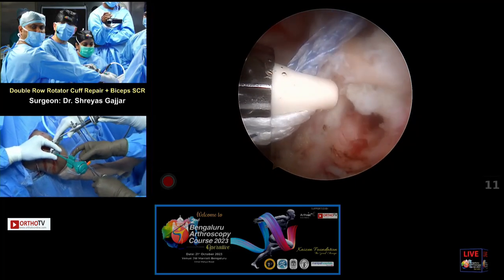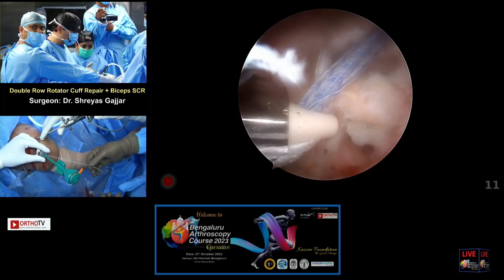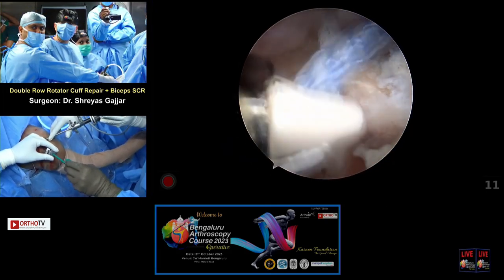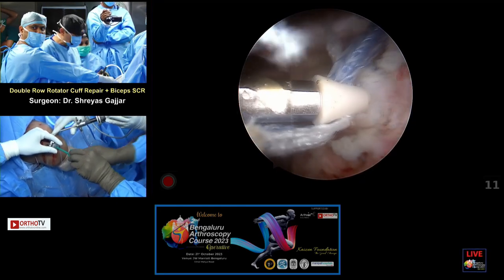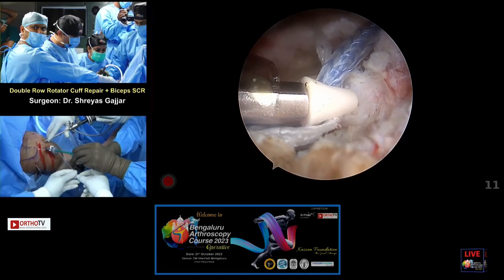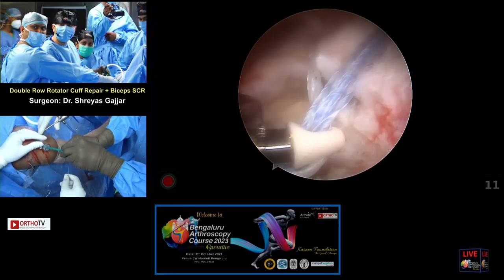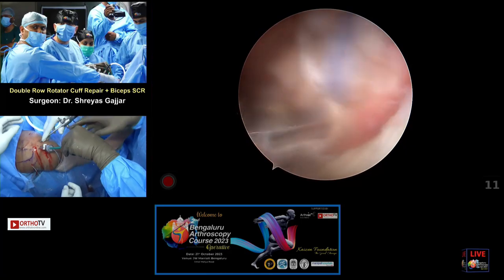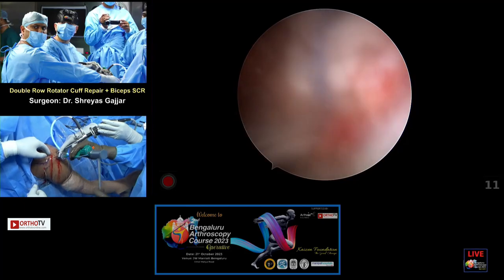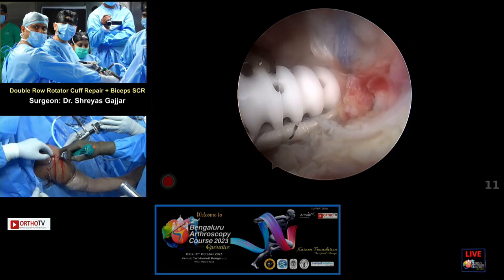Now, once you pass the eyelet through and it's near the lateral hole, you remove the mosquito from the tapes so that you can have a tension-free setup. What you need to do is come above the hole here, and then my assistant or I will pull the tape. So give me one tape at a time. Yeah, just hold on. That's enough so that you don't over-tighten the cuff. And then you bring it down to the hole. This is a good way to ensure that you have not over-tightened the lateral row. So again, I will hammer it till I get the anchor at the tip.